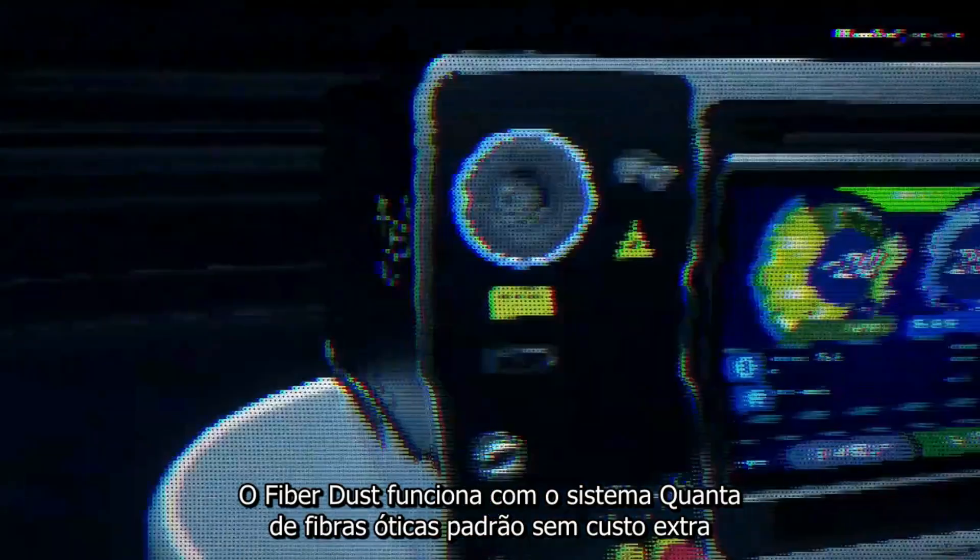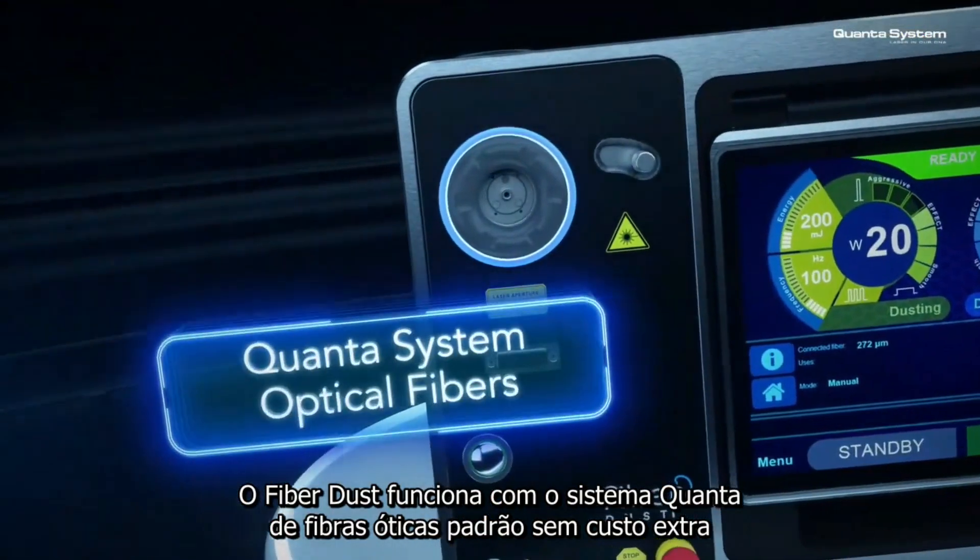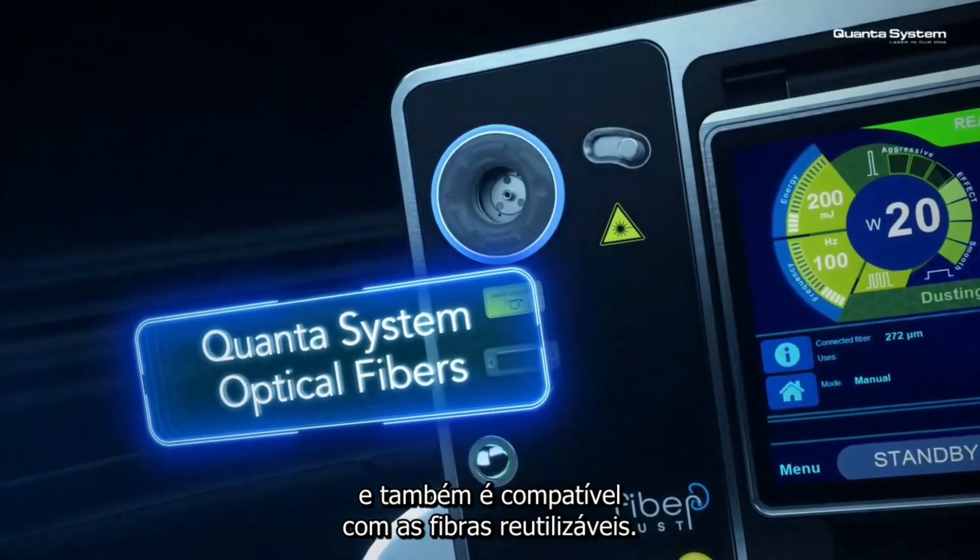Fiber Dust works with the standard Quanta System optical fibers without extra costs, and it is compatible with the reusable fibers too.